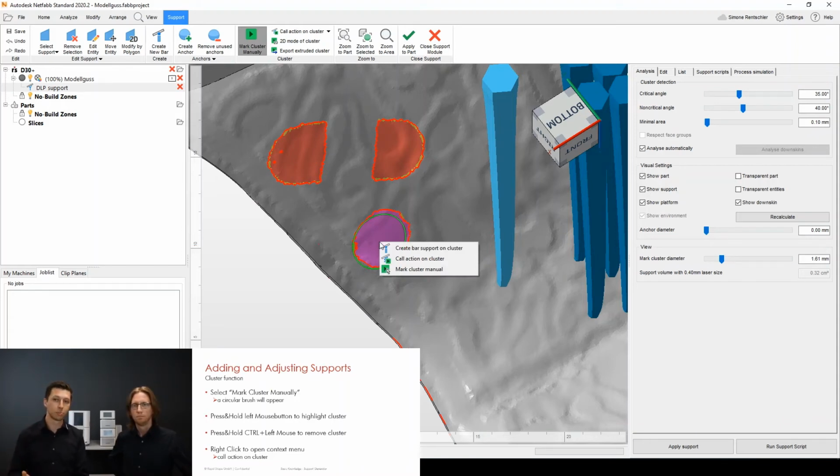First is create bar support on cluster, but this is just creating a standard bar support. So no special action, no special support script. So the best option now is to say call an action on the cluster.